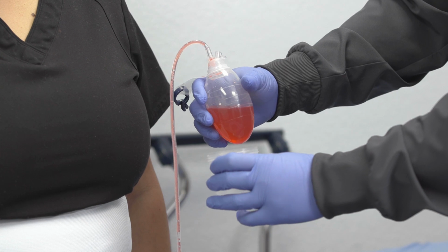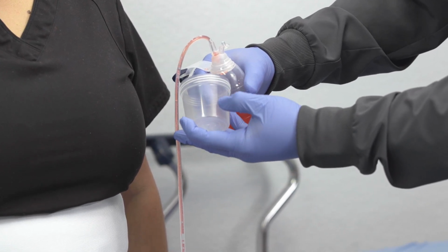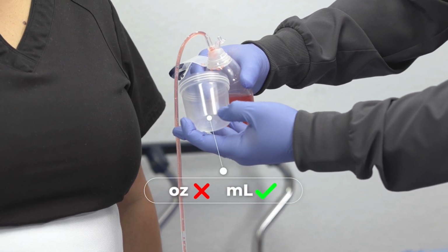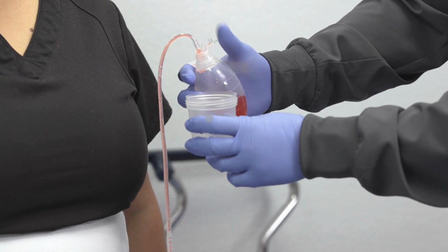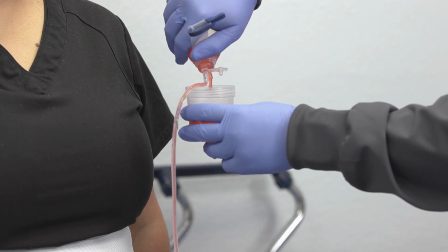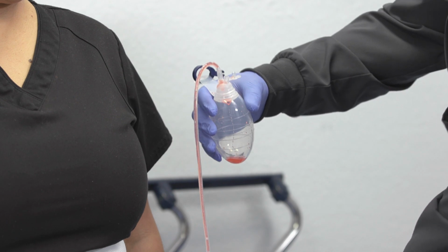You will then take the measuring cup. You will notice the measuring cup has markings on one side of it. It has ounces and milliliters. You want to make sure you are using the milliliter measurements for the amounts that you get. You will then hold your cup with one hand, tip the bulb over, and squirt out the fluid gently until the bulb is empty. If there is a little bit of fluid left in the bulb, that is okay.